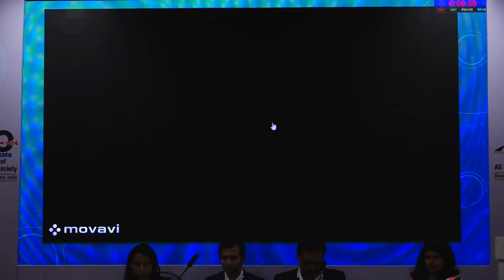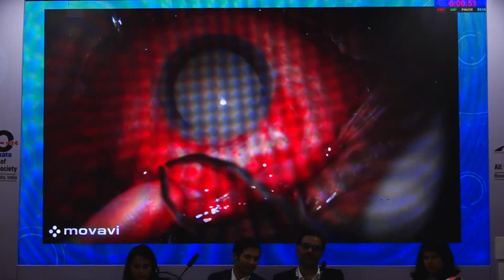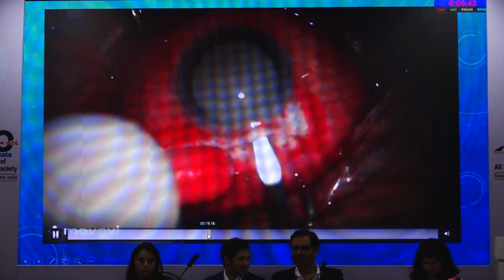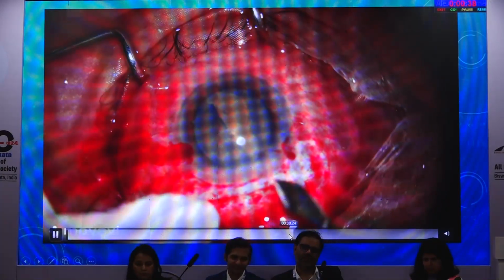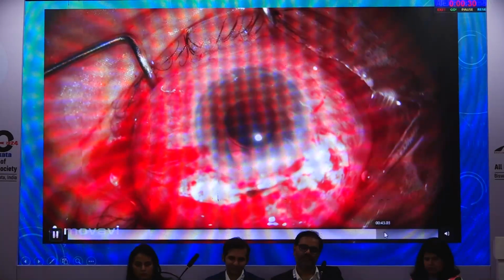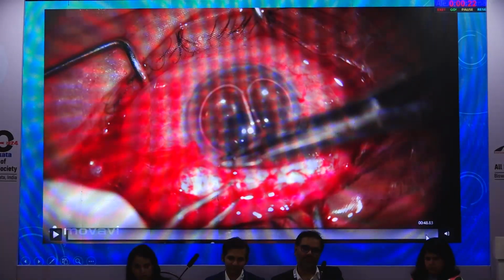Just see, it's a very small video of a recently done SICS, which I did after a pretty long time. As you can see, it's a very intumescent and hard brown cataract. The moment we started with the rhexis, even after aspiration of the milky cortex, the rhexis had a runoff and there was an Argentinian flag sign. So you ended up with this kind of a complication. Despite this, we could salvage, we could take out the nucleus, we put the foldable IOL in the bag and the rhexis margin that we could, and we could give a good result for the surgeon.